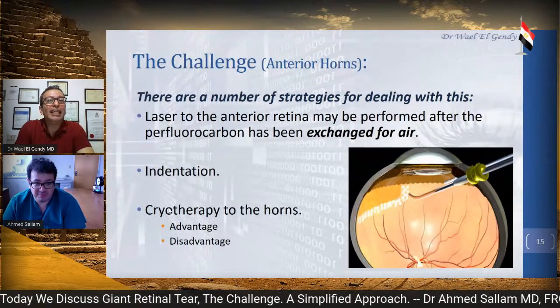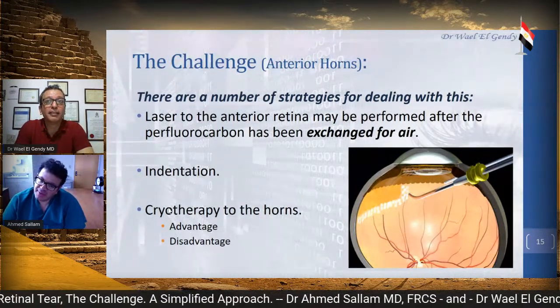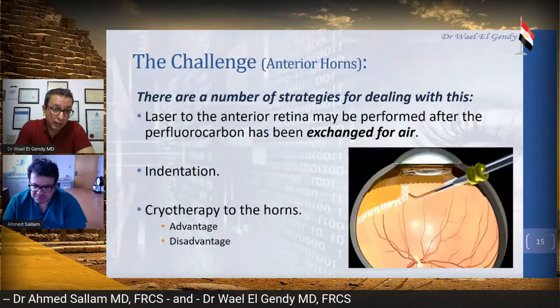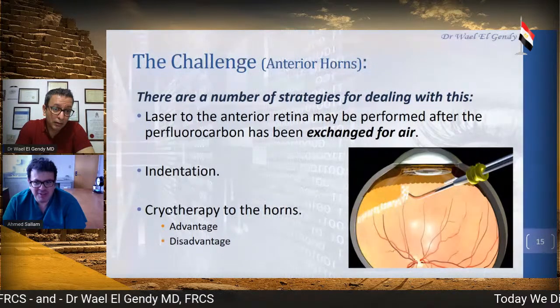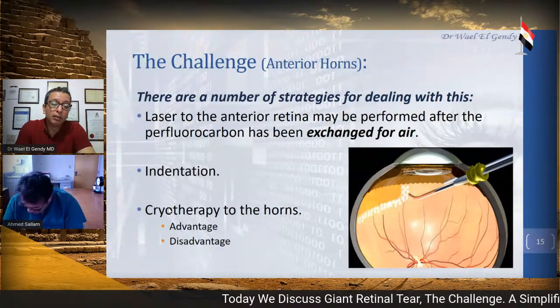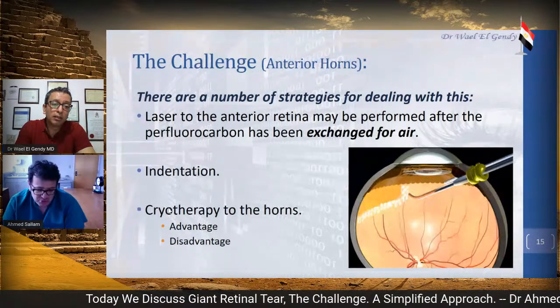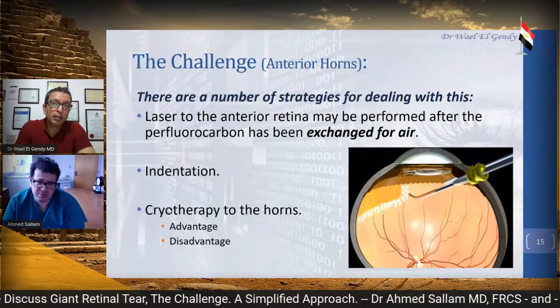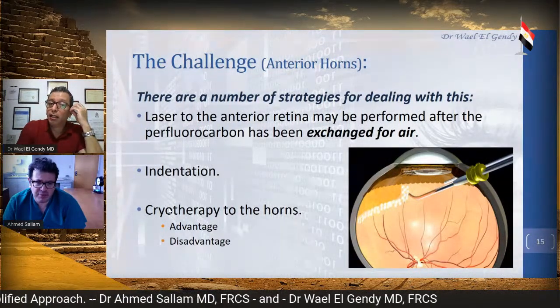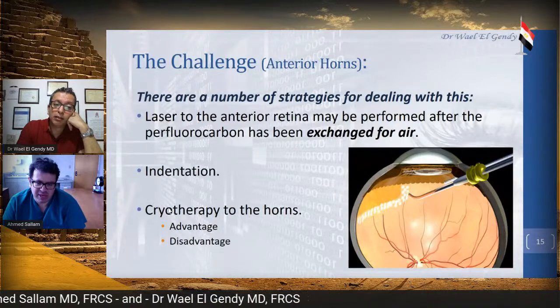Okay. So why do you think people don't like it sometimes? I feel it's a myth. Really, people think of cryo as a taboo, and I really don't agree. I think that many of the UK surgeons just use cryo for 1 or 2 tears during detachment. I don't think the risk of PVR is significantly high if you use it really carefully.